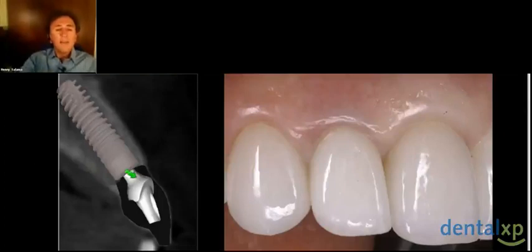And then having an abutment, as you see here, that actually built into it is, besides the platform switching, that creates distance from the connection of the implant to the restorative abutment, which is further away from the labial plate. We also have a built-in straight to concave emergence profile that allows us to have a much thicker tissue in that critical zone where color becomes very, very important, as you see here on the right part of your screen.